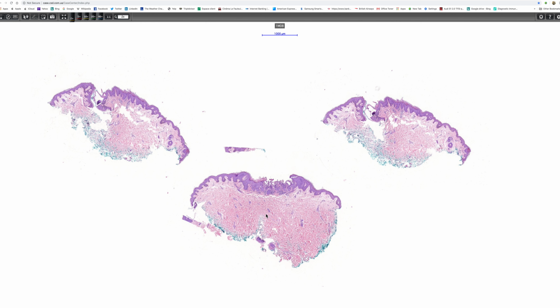And so at the end of this, my diagnosis would be an acantholytic acanthoma.